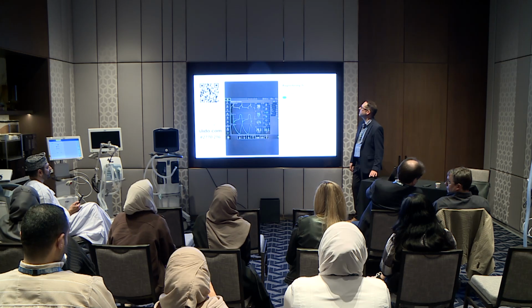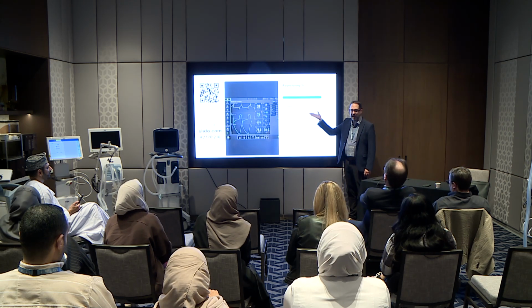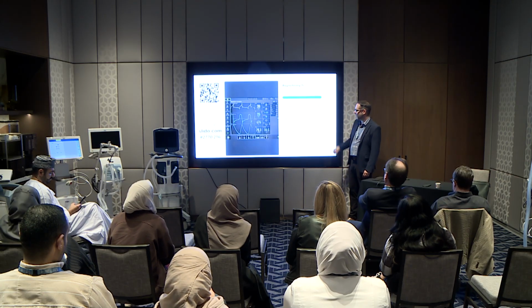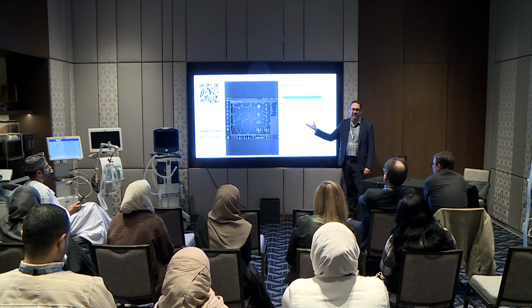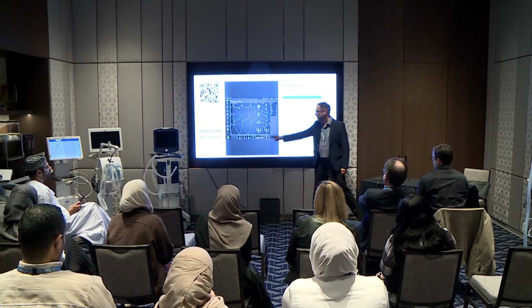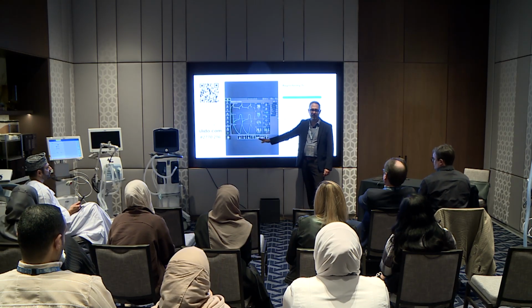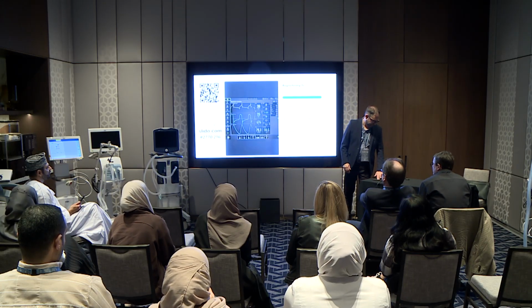There we go. Okay, correct. Yes, I would do that if this was any other patient, and I did try to do that, so that's not a wrong answer. This one was the third. This is what we ended up doing with this patient: we proned her. So all not wrong. Decreasing the inspiratory pressure, I would definitely not turn the pressure control any lower than 6 centimeters of water. Clearly, that's not going to fix the problem, and nobody chose increased I time, so that's good.